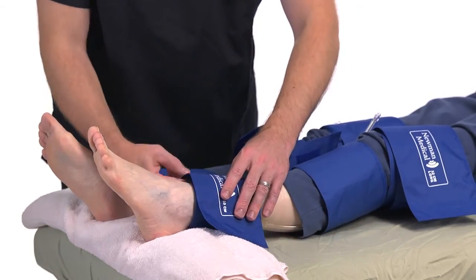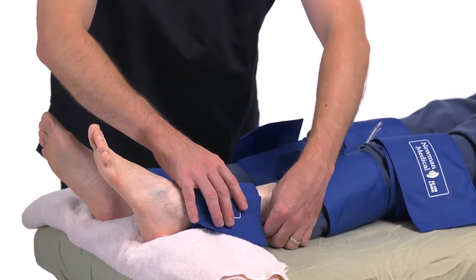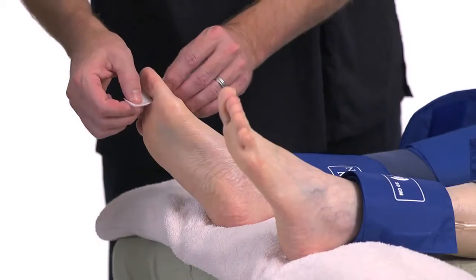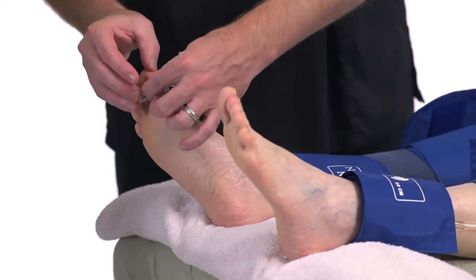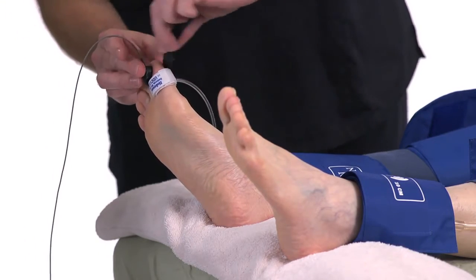When wrapping the cuffs on the legs, the patient may try to hold their leg up to help, but ask them not to because when they relax their leg, the cuff may loosen. When wrapping digital cuffs on the toe, try to wrap it down on the toe far enough that you will still be able to get the PPG probe on the end of the toe.